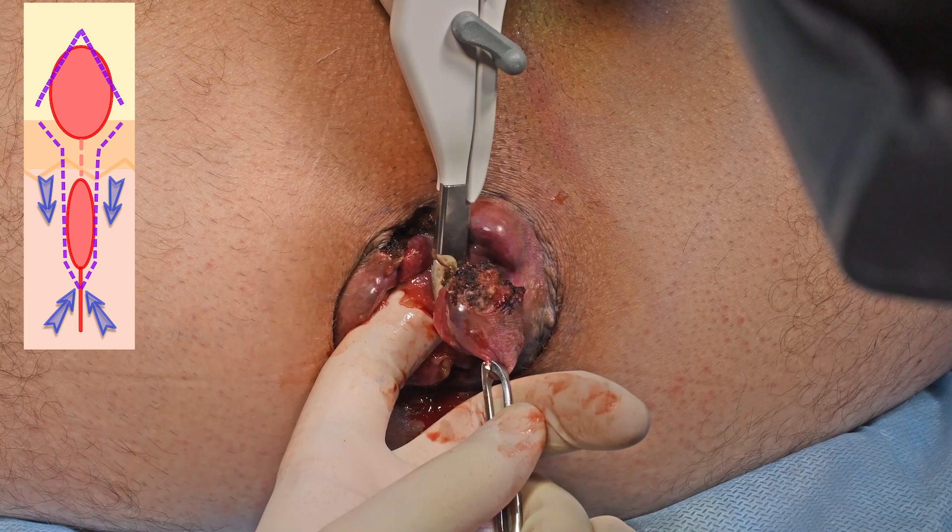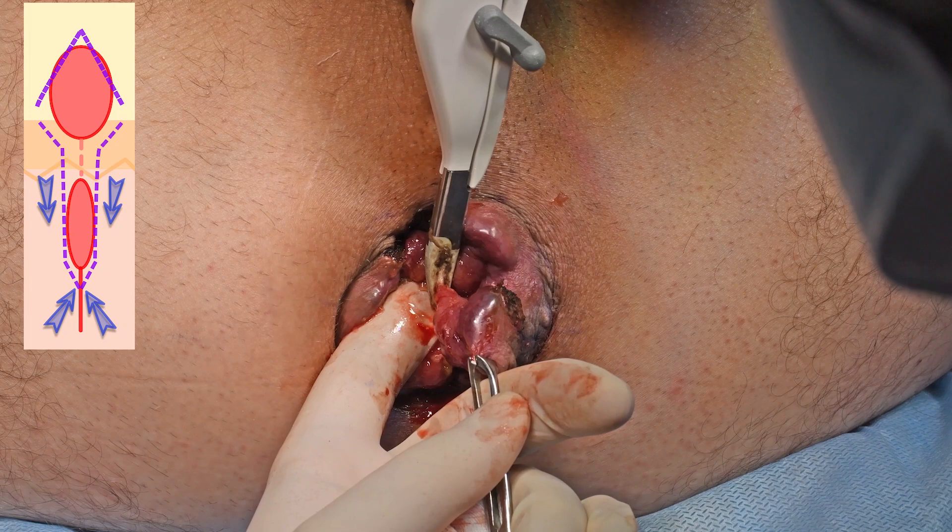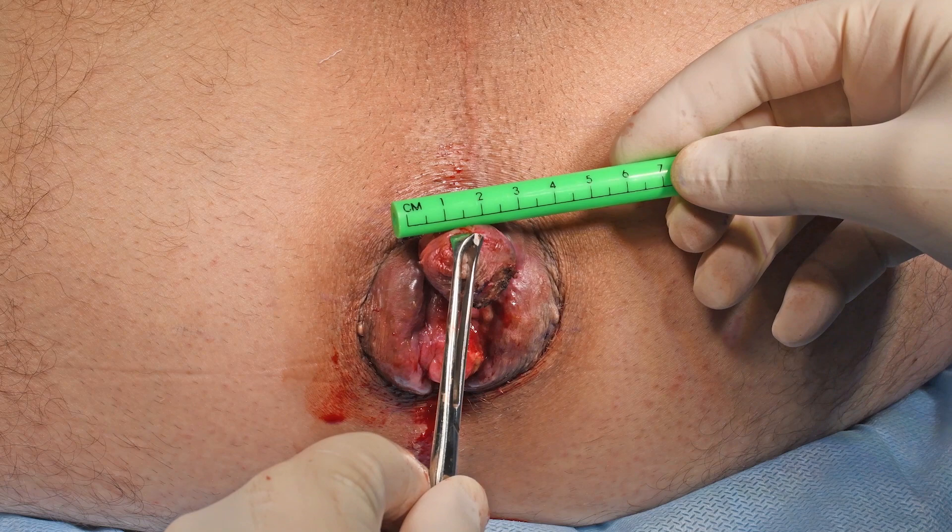When assessing the size of the defect, the maximum width of the wound in the distal part is 2 cm. The previously described steps are then repeated with the right lateral complex.